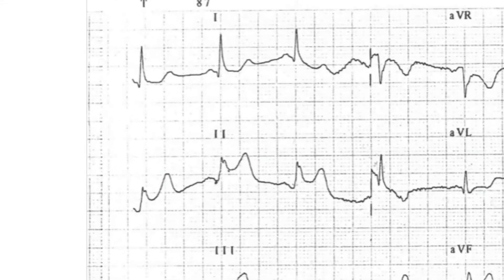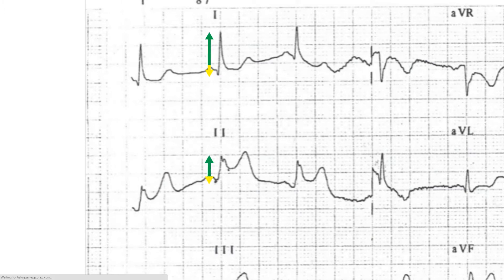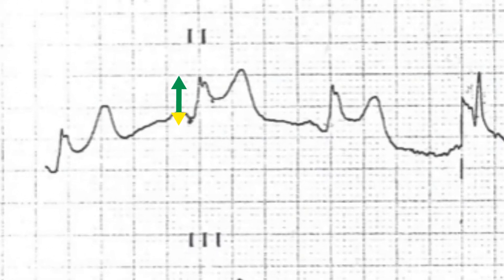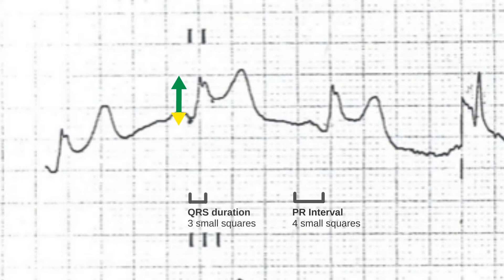The axis is normal with an upright complex in lead 1 and lead 2. The PR interval is normal measuring 4 small squares and the QRS complex is normal in duration measuring 3 small squares.